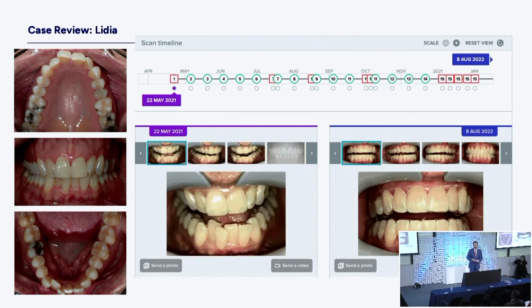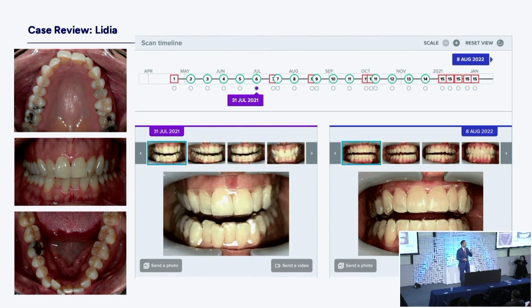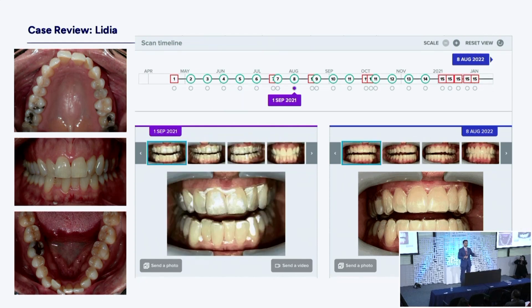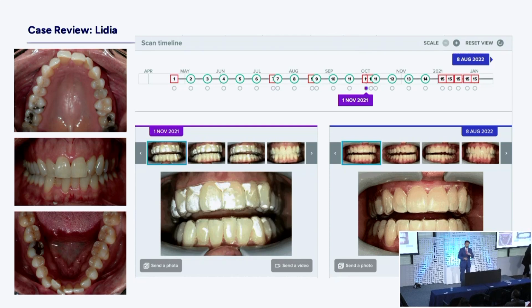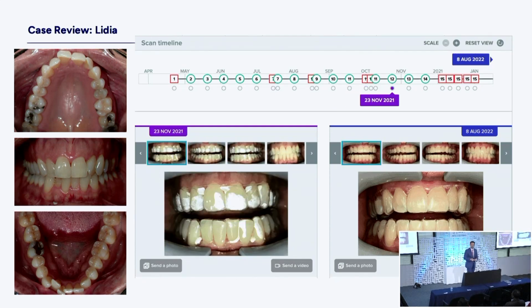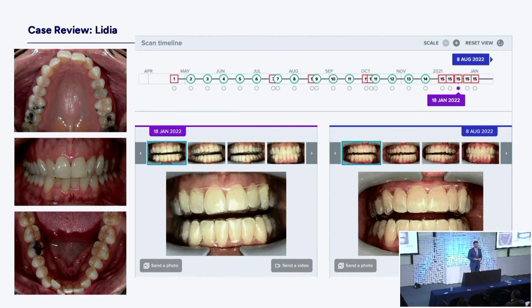If you get a red square, like at number 7 has a red square. After wearing 7 for 2 weeks, it was not a confirmed accurate scan. The teeth had not responded enough. She wears 7 an extra week to get the good scan. Happened at 9 and 11 as well. 11 had to be worn 2 extra weeks. 11 was a 4-week aligner to achieve the movement.